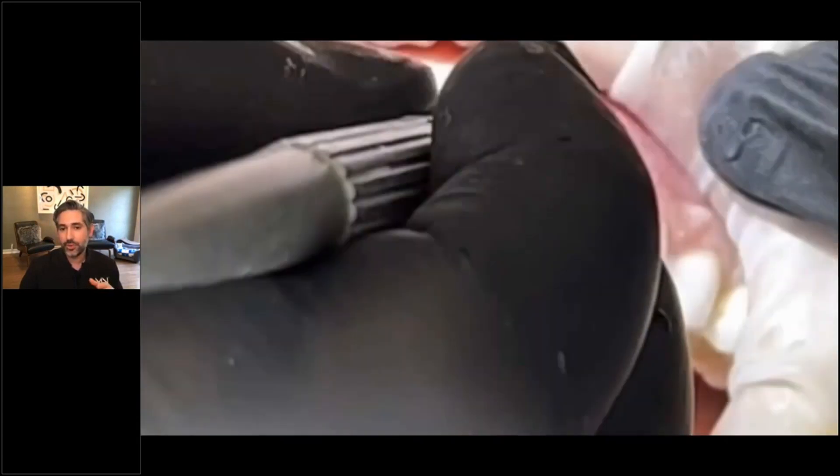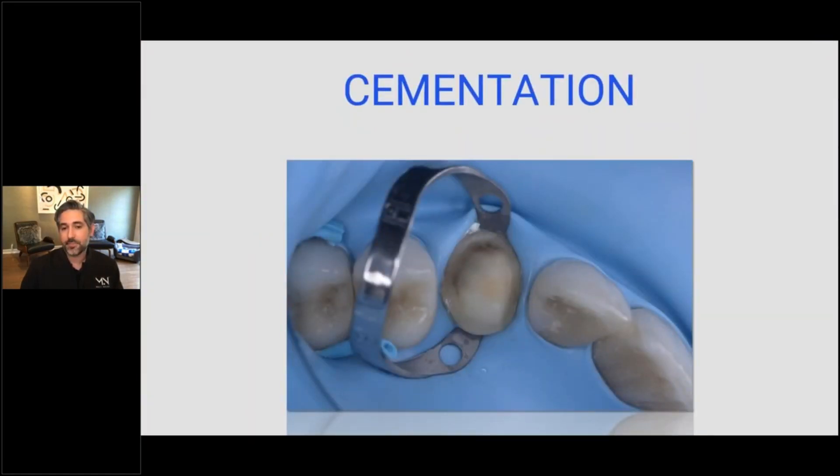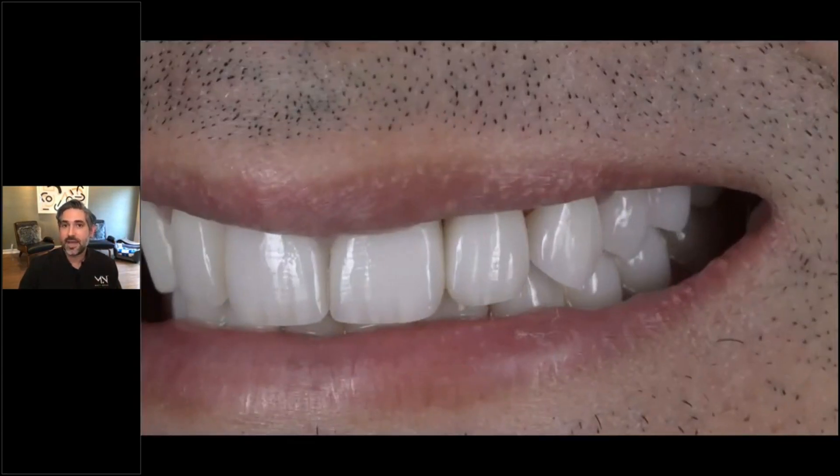You can remove the excess and stain and glaze intraorally in one go. Here I'm just applying a little bit of cervical stain, a little bit of glaze — nothing too fancy, it's only going to be for a short time — and I give that a final cure so it's got a nice appearance. The shade I used was a bleach shade, so I can tone it down if needed. Then on the cementation appointment, I use rubber dam and heated composite. I tried in the restoration and unfortunately the shade was off. But I've been doing more and more stain and glaze on both provisionals and ceramic, so I was able to correct it myself. It was too high value — I added some additional A shade using Lustre Paste 1 from GC and got a really nice result. The patient was very happy.